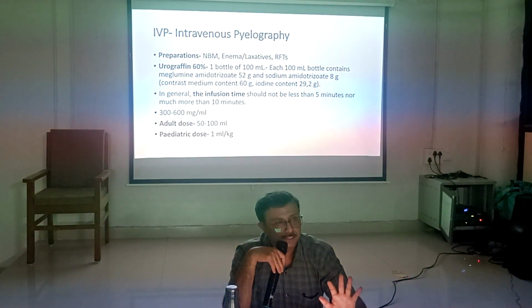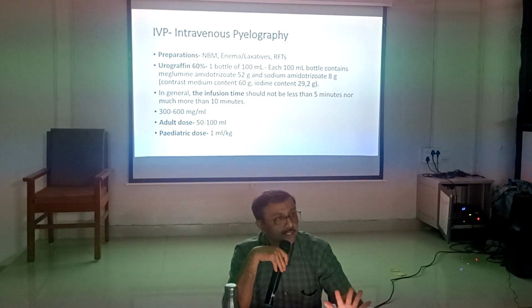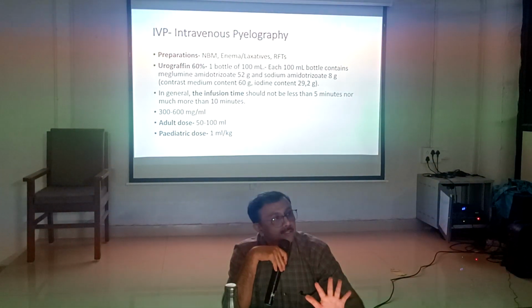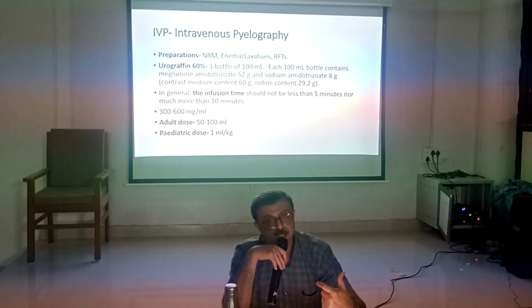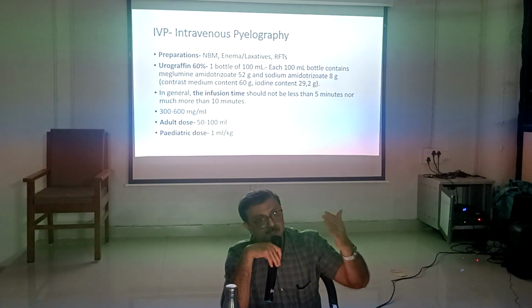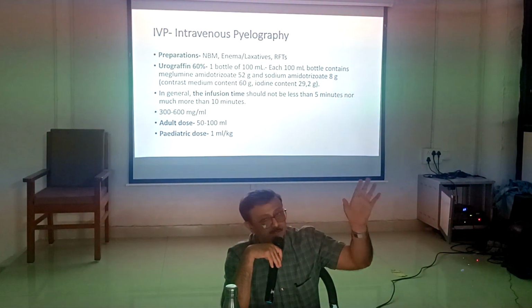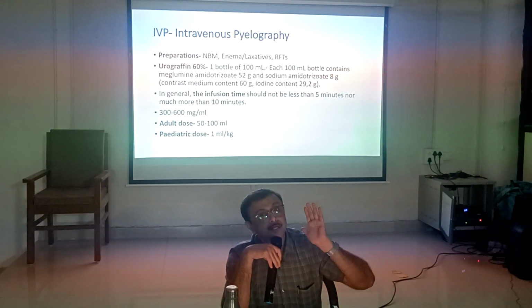Intravenous pyelography. This is again a specialized procedure showing dye in the urinary tract. So dye is injected intravenously and then sequential X-rays are taken within a specified time duration, up to 24 to 48 hours, depending on when the kidney completely excretes the dye.